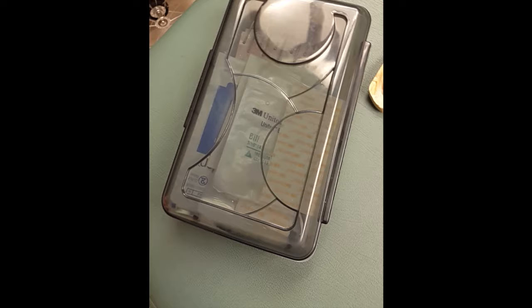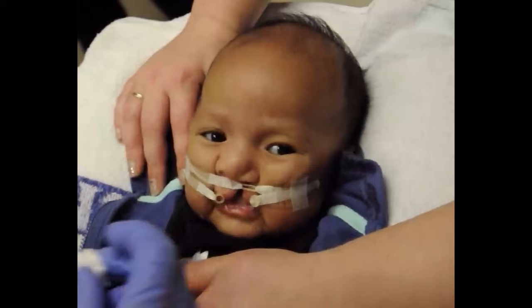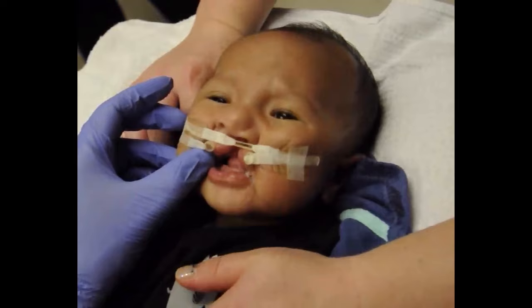Parents are given supplies at the beginning of NAM treatment and at every visit as needed. NAM visits occur weekly or bi-weekly. At each visit, the orthodontist will make changes to the appliance to gradually mold the lips and nose.